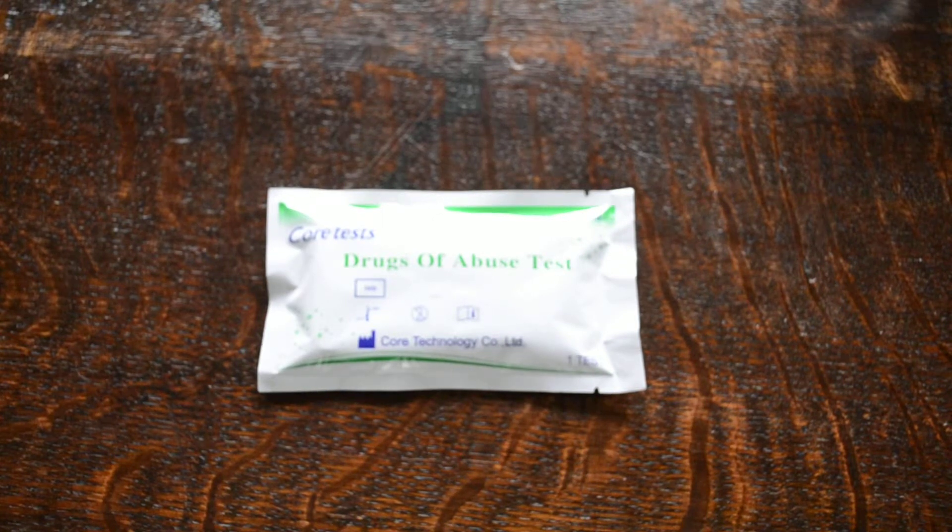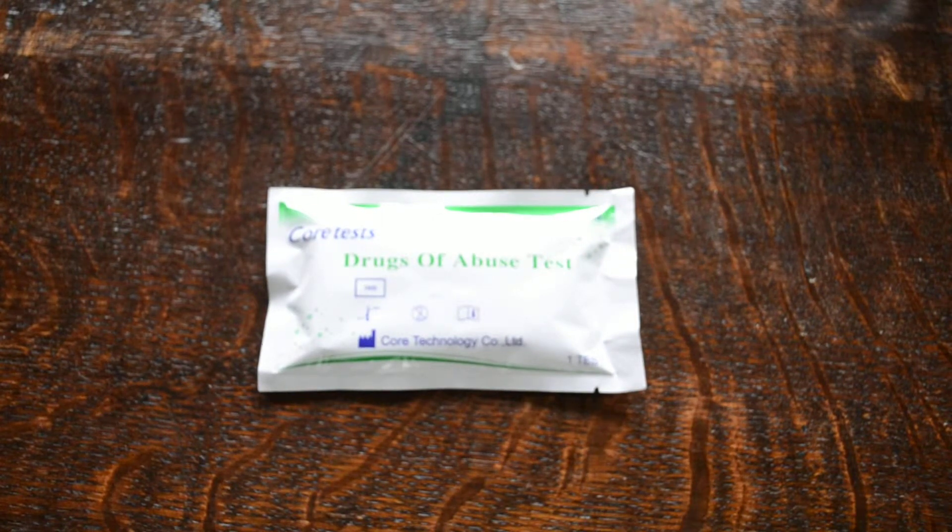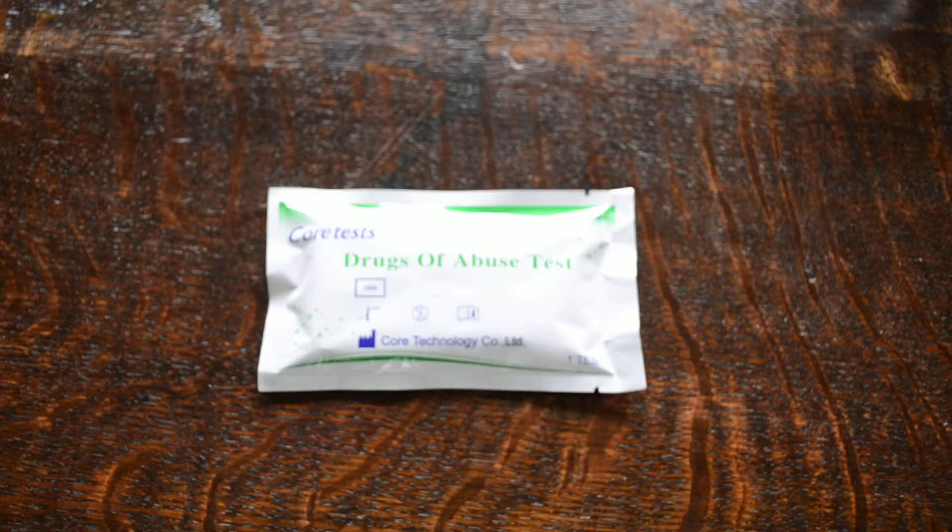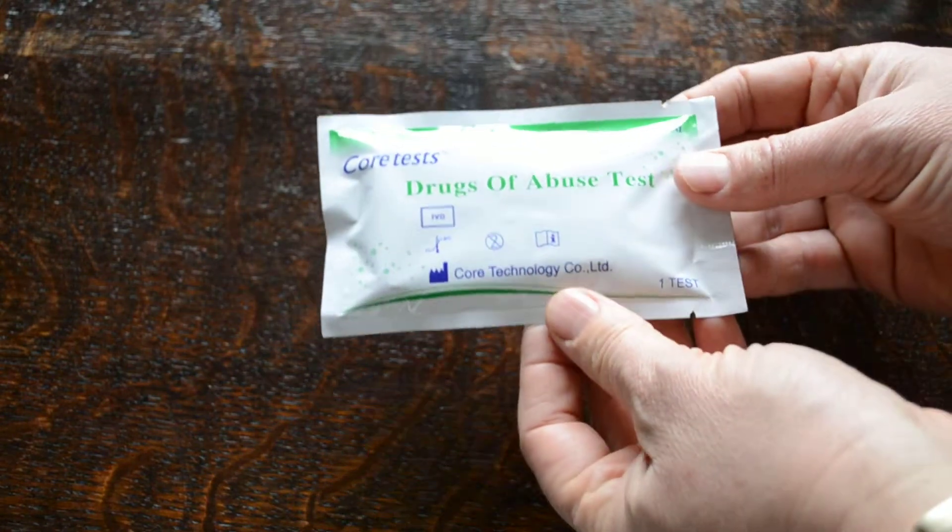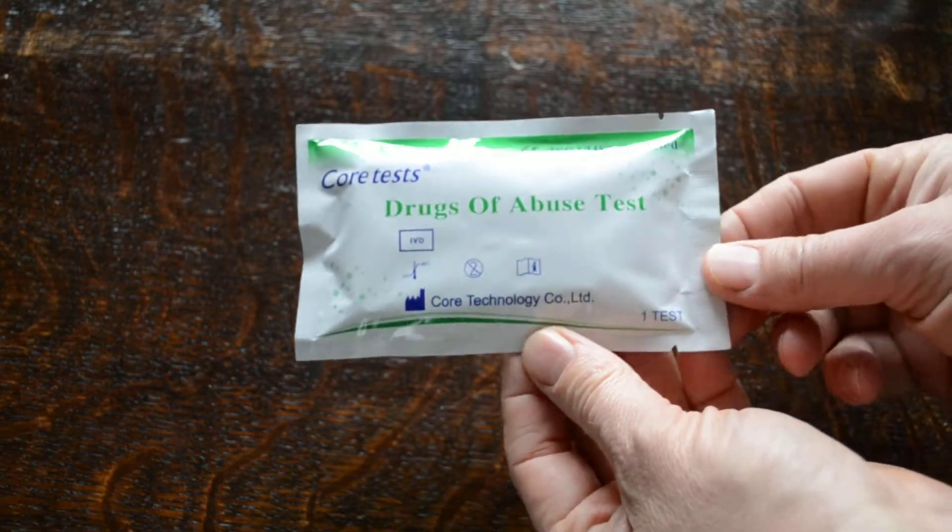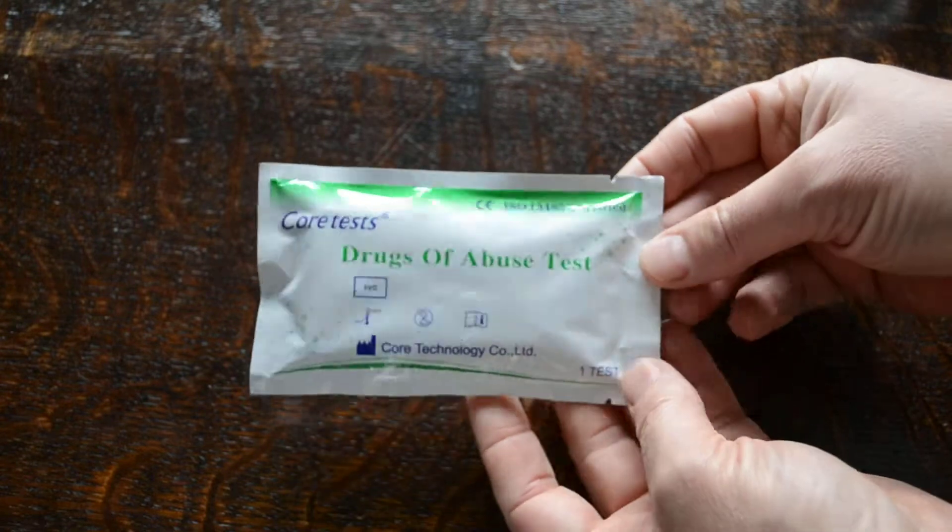Okay, we're going to demonstrate for you in this video how to do a seven-panel drug testing kit. This is the CoreTest Drugs of Abuse Pack. This is manufactured by Core Technology. It's an in vitro diagnostic device, which means it's a quality certified medical device for testing.